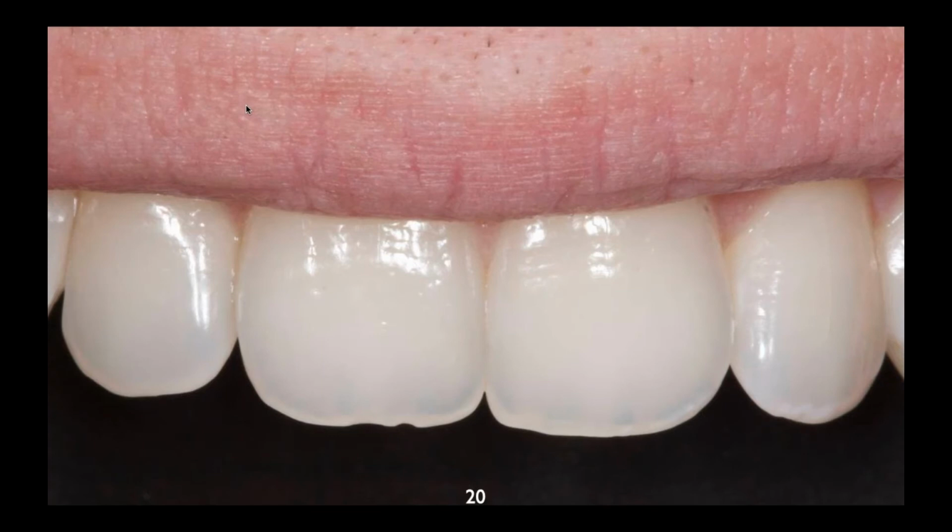And he made these halos by grinding at a 45-degree angle, starting from the outside towards the lingual. And the problem with that is that it really weakens the incisal edge. But anytime you cut glass to a fine edge like that, you always see, like a regular glass pane, the silica glass has sort of a greenish halo to it. But we don't want that. We want to do that with color.